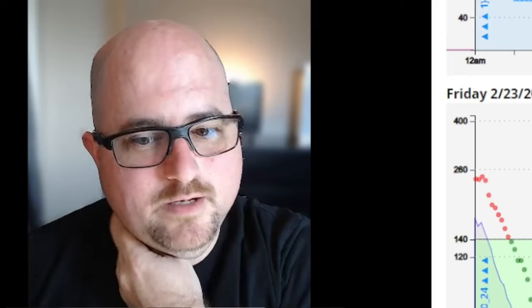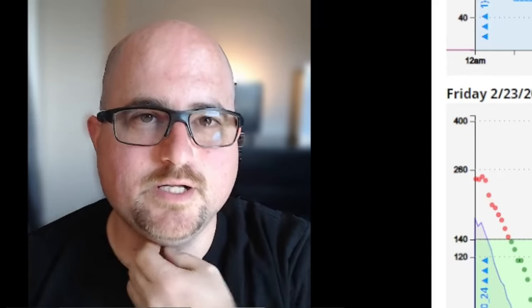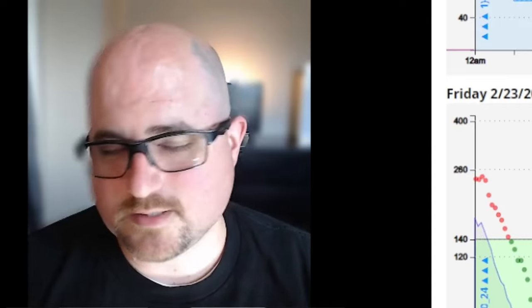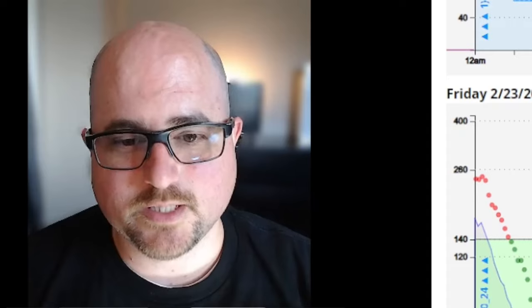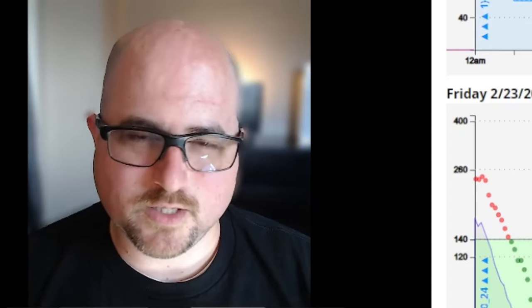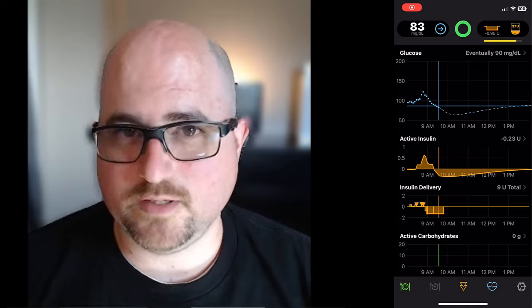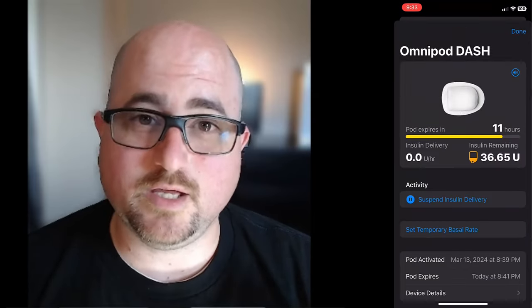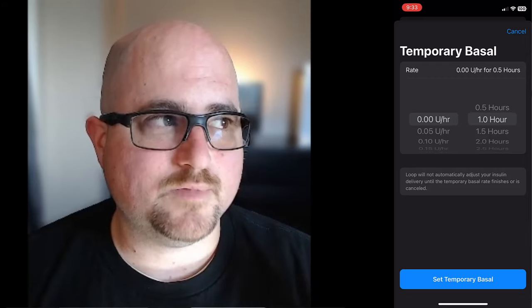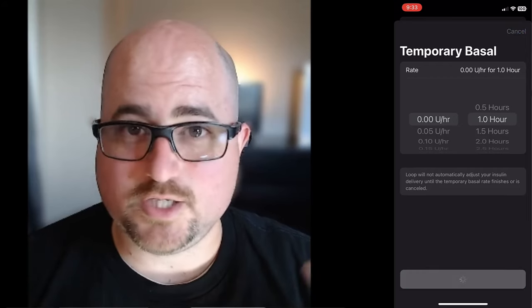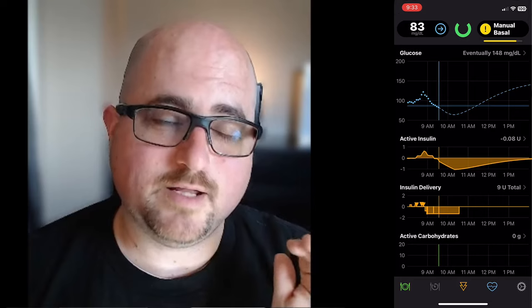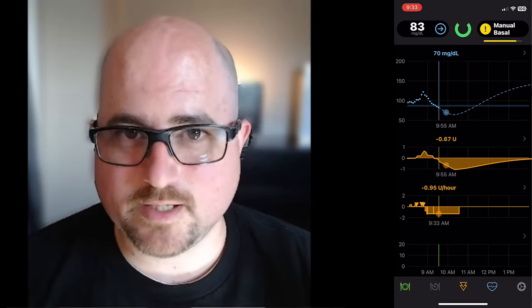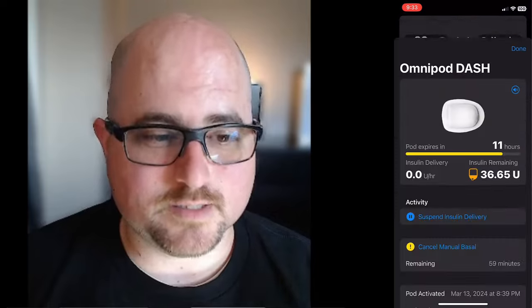Let me affirm your decision to use higher target overrides for activity — gold star, good job. Not trying to do percentage increases or decreases in insulin — that just complicates trying to figure out what things should be. Shooting higher is good. One thing I'll also point out: temporary basal rates are now in Loop and have been for a while. So if you think you just need it off and don't mind that there wouldn't be any automation, you can just set a zero or lower temp basal rate for half an hour or an hour if you feel like you just want it off. But higher target overrides is great.